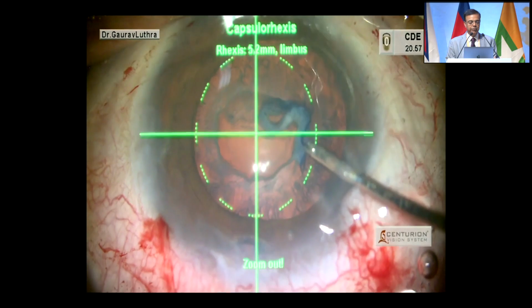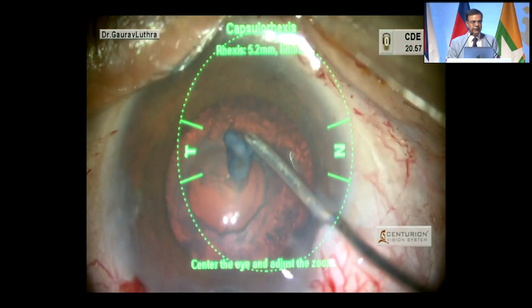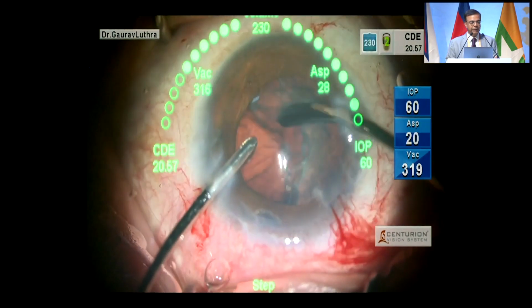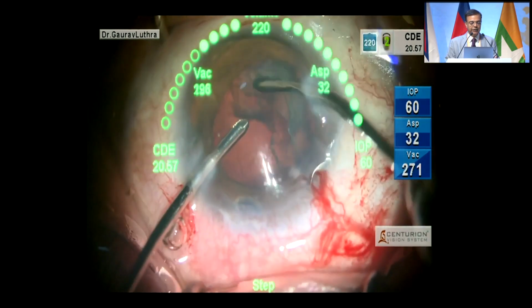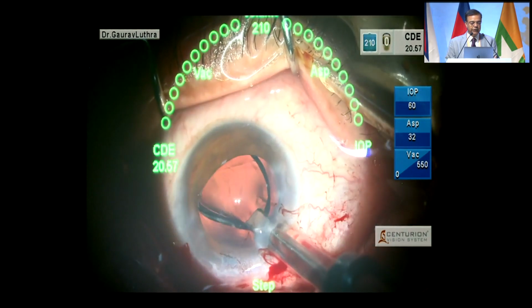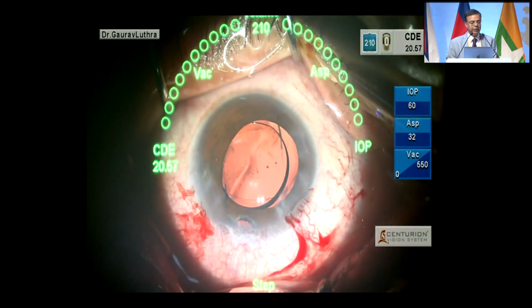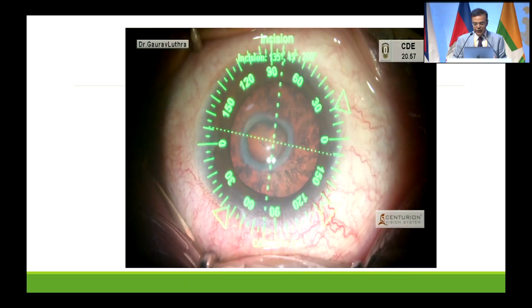Ideally, on table, you should be sure that you've got your landmarks right and you've implanted the lens in the correct orientation. It's usually easy to see for an experienced surgeon, but even some experienced surgeons may miss the fact that the ICL opened up upside down unless they are extremely careful. Intraoperative OCT has made a lot of difference, and now we can actually see the vault on intraoperative OCT. But the first thing on post-op day one should be to look for the vault on the slit lamp, and an OCT documentation is a great idea.